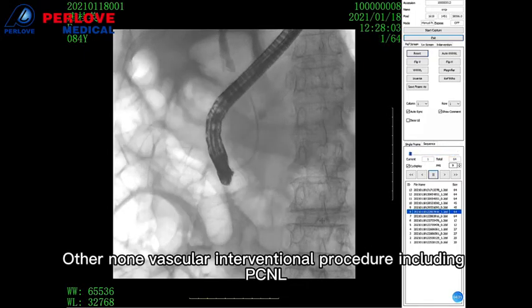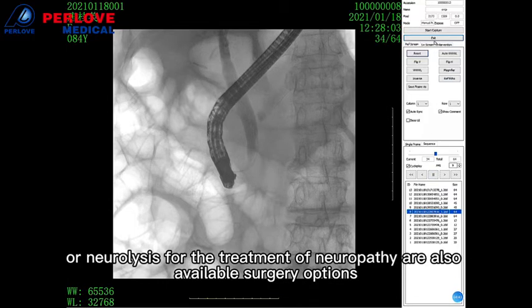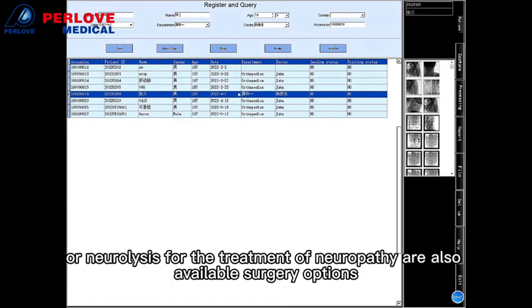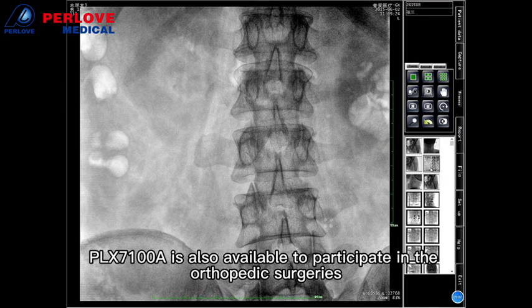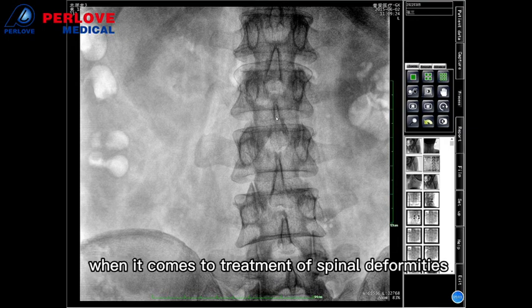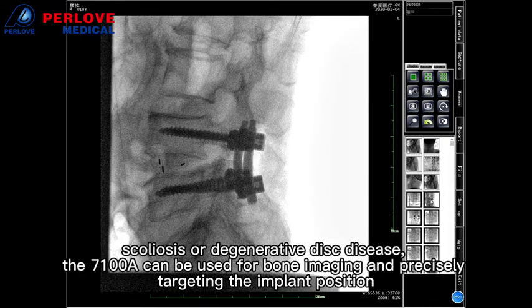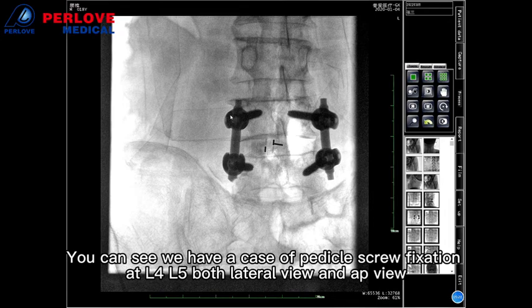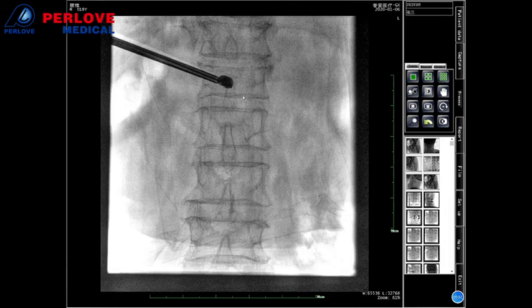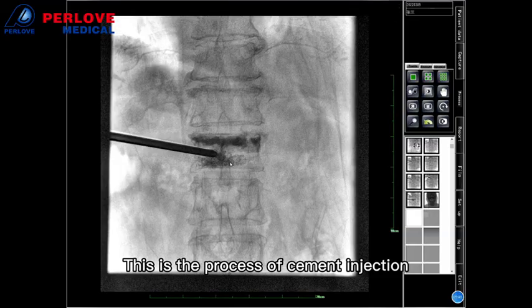Other non-vascular interventional procedures including PCNL — percutaneous nephrolithotomy for removing kidney stones — or neurolysis for treatment of neuropathy are also available as surgical options. In addition, the PLX-7100 is capable of participating in orthopedic services. For treatment of spinal deformities such as scoliosis or degenerative disc disease, the system can be used for bone imaging and precisely targeting implant positions. You can see a pedicle screw placement at L4 and L5, both in lateral view and AP view. This is a case of vertebroplasty, and this is the process for cement injection.